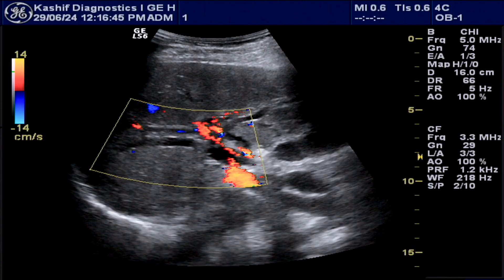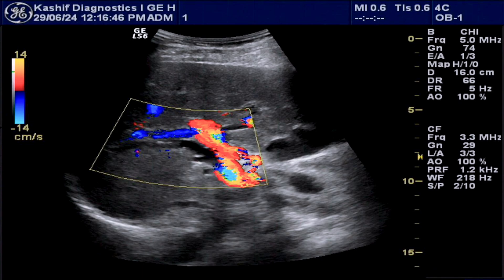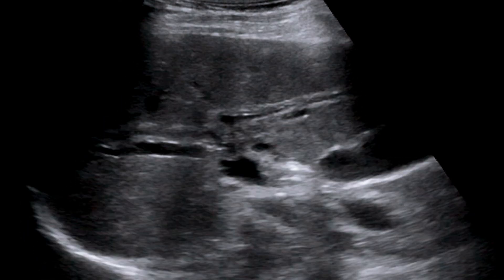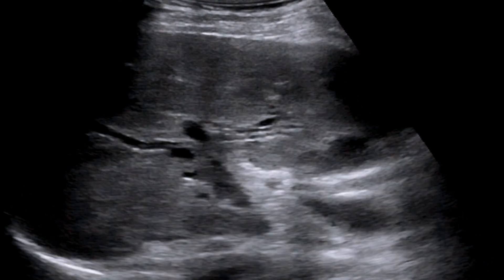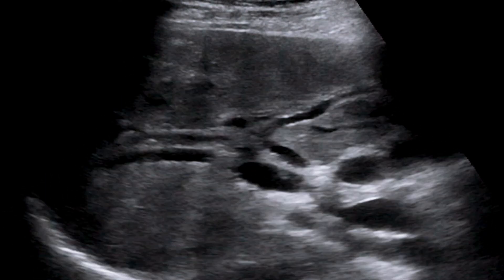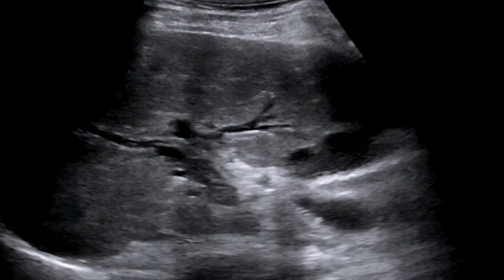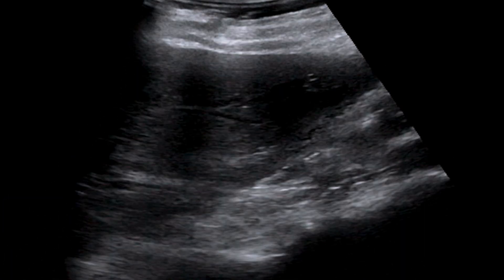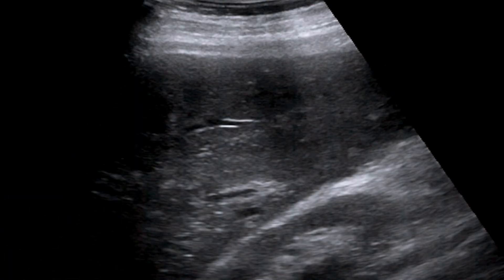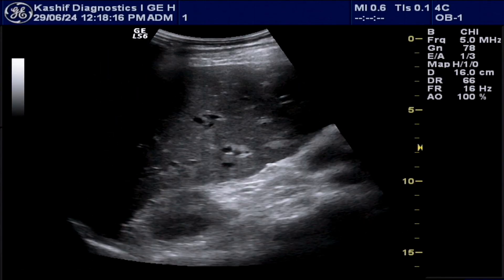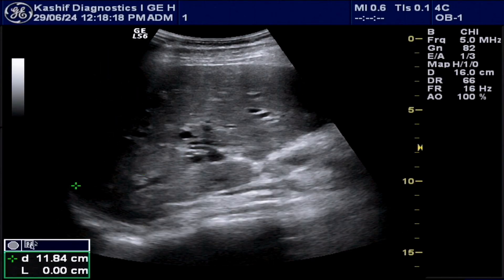As we see in the color Doppler, there is color flow in the right segmental branch of the portal vein. The normal intra-hepatic biliary duct is less than half the size of the anterior segmental branch of the portal vein. So this is a significant case of biliary obstruction.